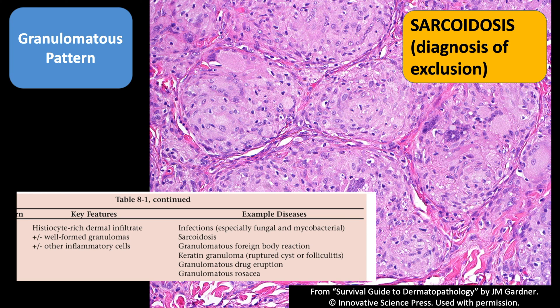Also in the skin, remember to polarize whenever you see granulomas. The skin often gets foreign material in it from previous injury, so finding polarizable material in the granulomas can be really helpful. It's also really useful to think about ruptured hair follicles and cysts, which will make keratin-based granulomas.